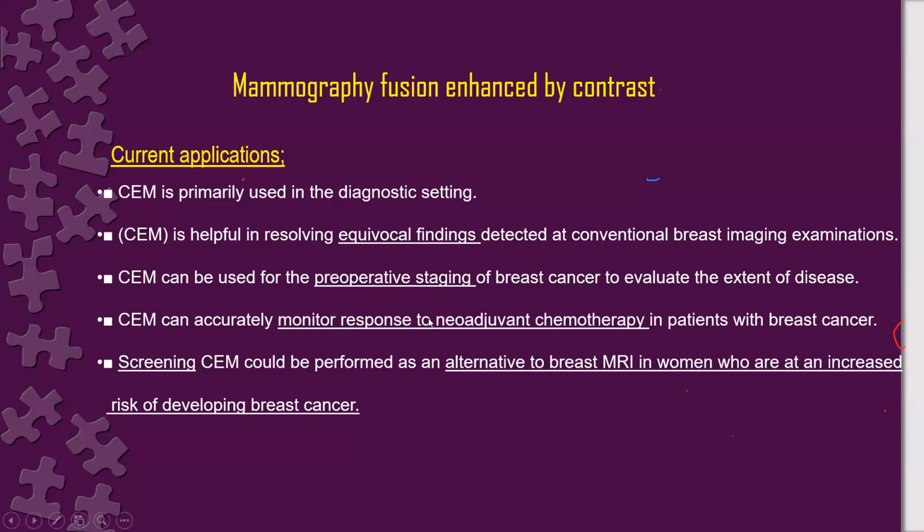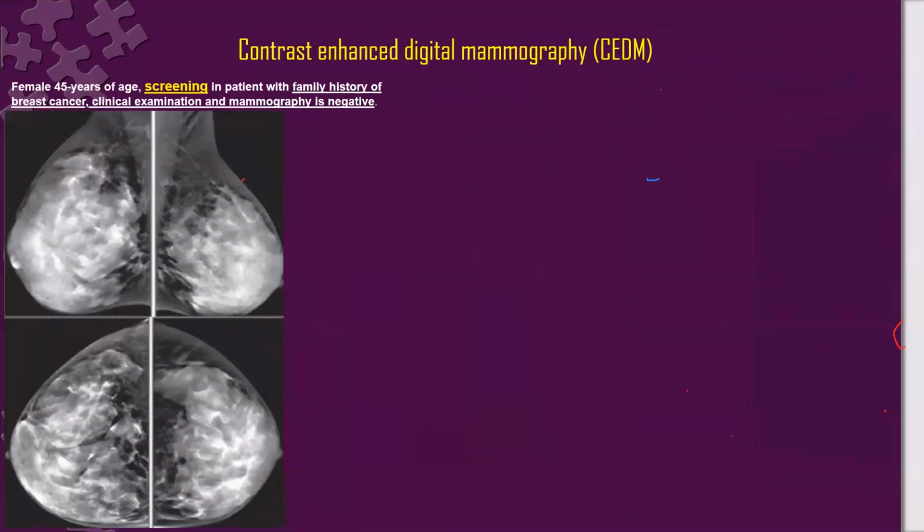It also can be used as an alternative to breast MRI in case of high-risk screening, adjuvant to mammography.